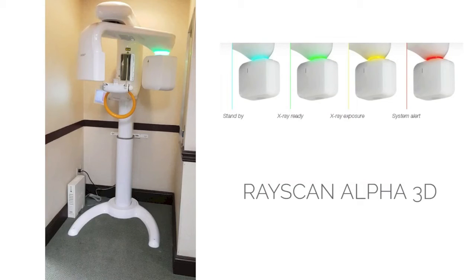Now, if you look at the head of this machine, you see all those colors: the blue, the green, the yellow, the orange. That's the light on the head of the machine, and it tells you at what point in operation the machine is, if it's on standby, or if radiation is being emitted. So when that cone is spinning around the patient's head, you know if it's safe to walk by in the hallway or not. You don't necessarily have to stop and wait for the entire spinning to finish if no radiation is being emitted.